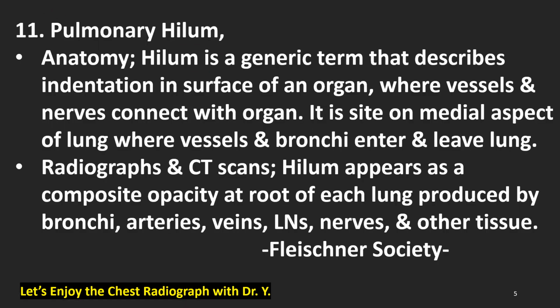Pulmonary hilum. Anatomy. Hilum is a generic term that describes indentation on the surface of the organ, where vessels and nerves connect with the organ. It is the site on medial aspect of the lung where vessels and bronchi enter and leave the lung. Radiographs and CT scans: hilum appears as a composite opacity at root of each lung produced by bronchi, arteries, veins, lymph nodes, nerves, and other tissue. Fleischner Society.